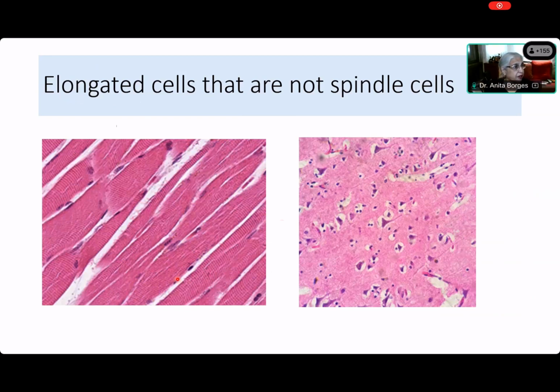All right, Shashank is taking time. Kedar, which is that other muscle? Smooth muscle cell, yes, because the smooth muscle cell is an elongated cell and it does have a spindle nucleus, and that spindle nucleus is sitting inside the cytoplasm and not at the periphery of that cytoplasm.